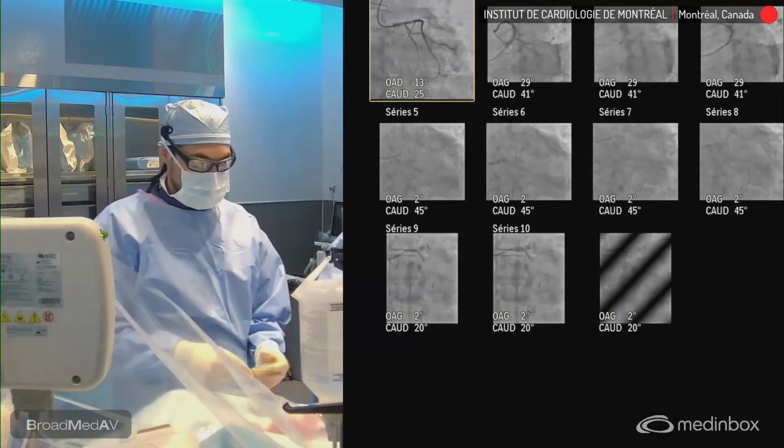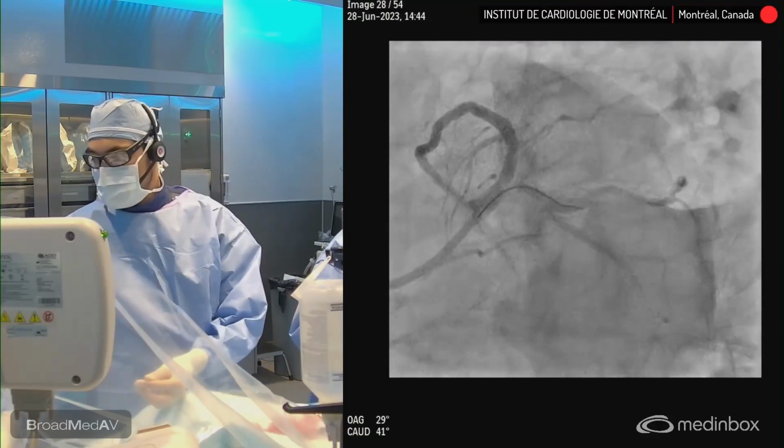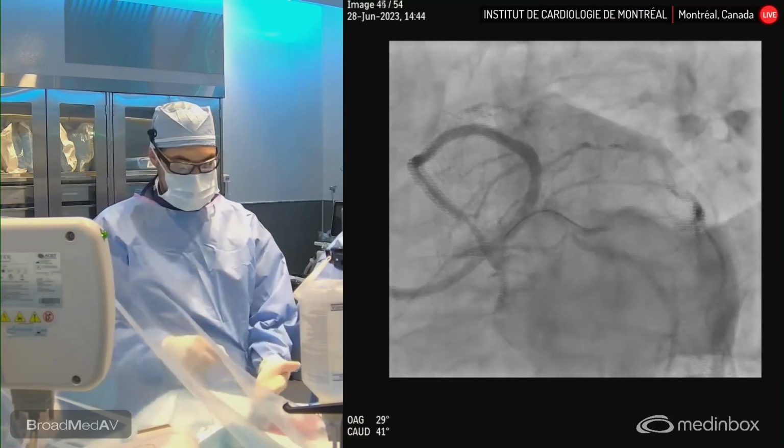Next slide. Next angiogram. Yeah, show it. Okay.